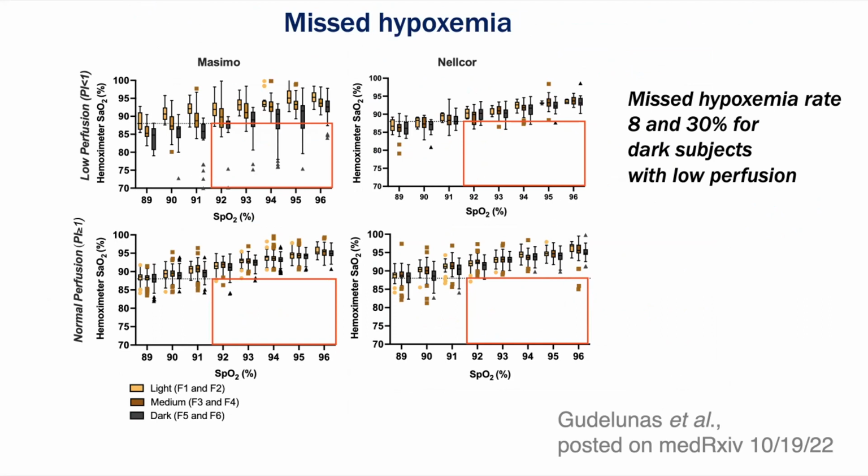And as clinicians, we at UCSF broadly agree with what Michael Schoeding said about the clinical relevance of this range, because if one has a pulse oximeter that is reading in the 92 to 96% range, and the patient's blood oxygen is 88% or less, then that's a significant clinical problem. And so the boxes show the percentage of values that fall into that categorization.